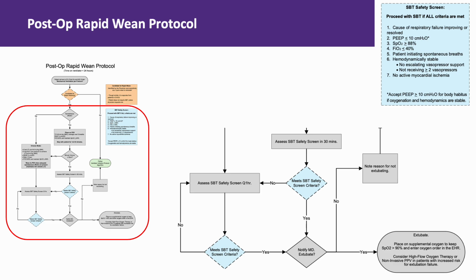Now here is a critical safety valve in the algorithm. If at any time the patient's not a candidate for rapid wean, meaning their clinical status has deteriorated or they are not progressing as expected, you proceed with the standard ventilator management protocol. Do not force a rapid wean on a patient who's not a rapid wean candidate. Recognize when the trajectory has changed and shift to the appropriate protocol.